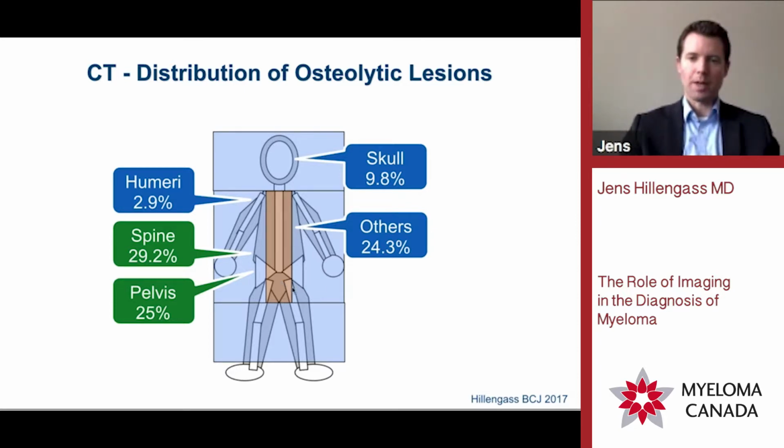But of course, if you have access to a whole body CT, it's even better, and also in the lower extremities. I have learned that really near to the real distal extremities, there are very, very few osteolytic lesions. I have seen that, but it's very rare, and so if they are not in the image, it's not a big problem usually.